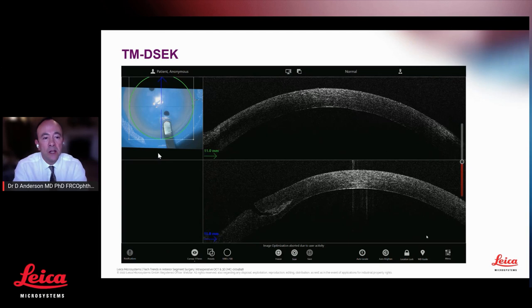So the corneoscleral rim is in an artificial anterior chamber. That artificial anterior chamber is full of air, and that's the reflection. Now, experienced surgeons are able to dissect down following that dissection until that reflection almost disappears entirely. But it is not an easy dissection to learn, and it is very easy to perforate. Also, you will see that the length of the Pofic knife is quite short.